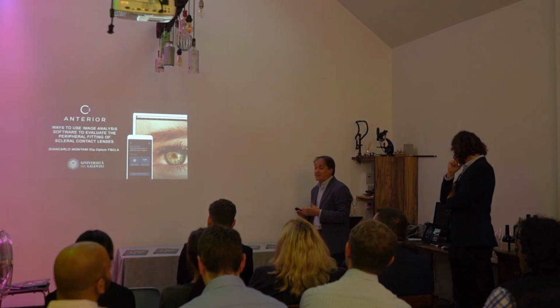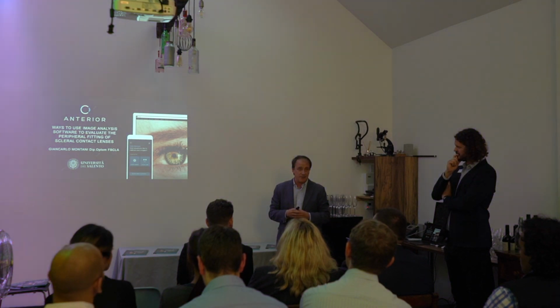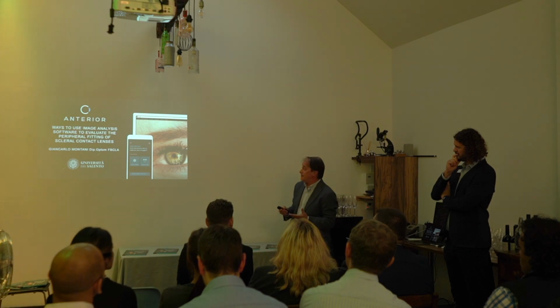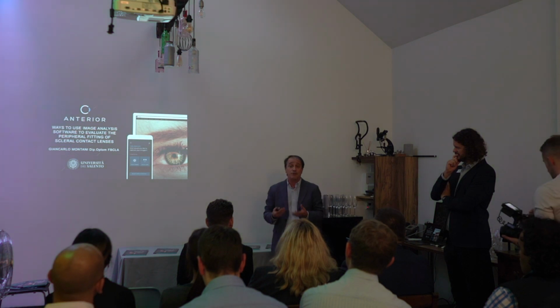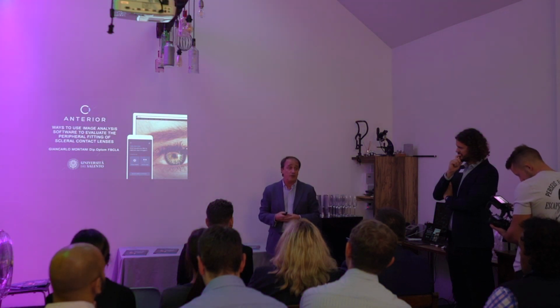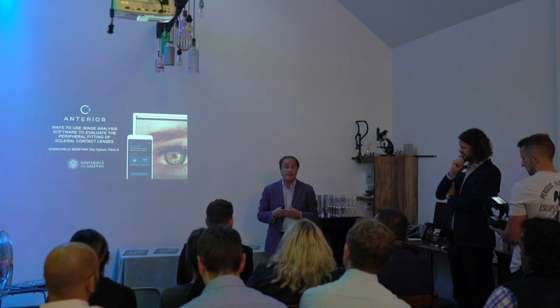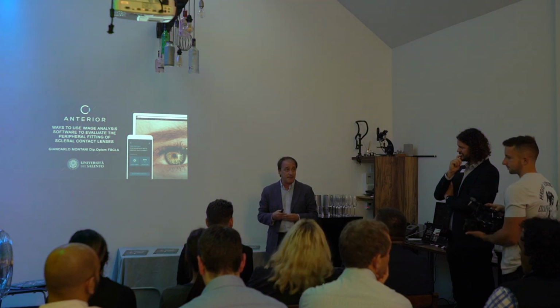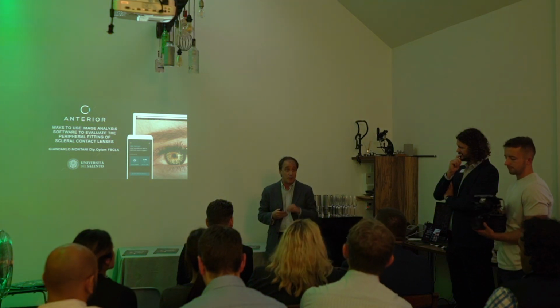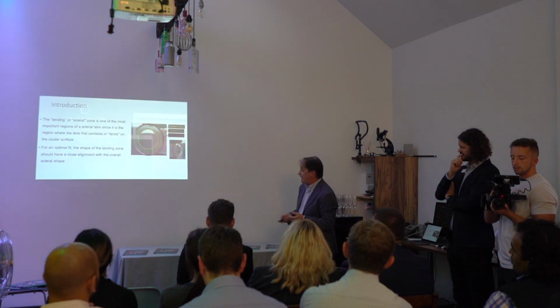So it's something very similar in some respects to the presentation of the bike, because I use this device to evaluate, I use the software to evaluate the effect of peripheral scleral lens fitting, and for this I've used some points related to the possibility to evaluate in an objective way something very difficult to evaluate just using the slit lamp.